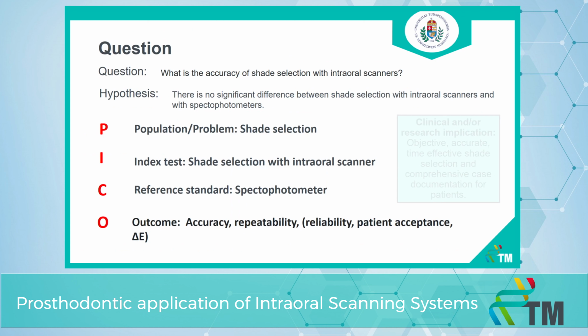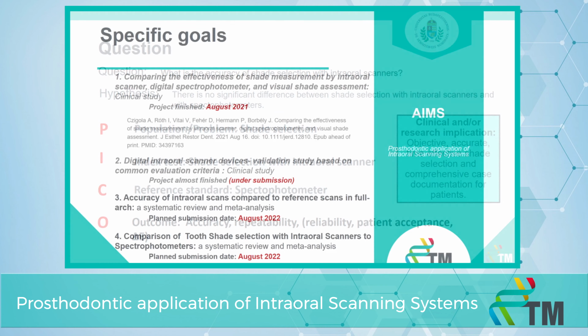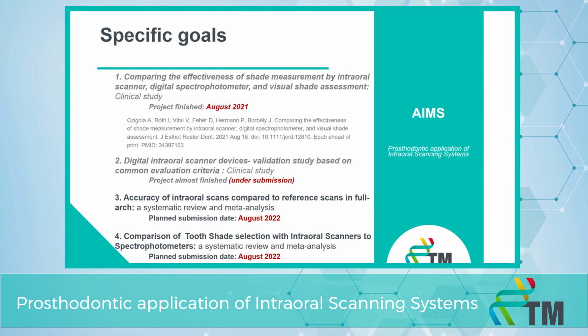So if we are right and they are available for everyday use, they can be an objective method and can be as accurate as spectrophotometers. They can give us time-effective shade selection and comprehensive case documentation for patients. Of course, you don't need another device for this method. My specific goals are to finish both of these meta-analyses until August, and of course to finish the clinical study on the validation part of intraoral scanning systems.